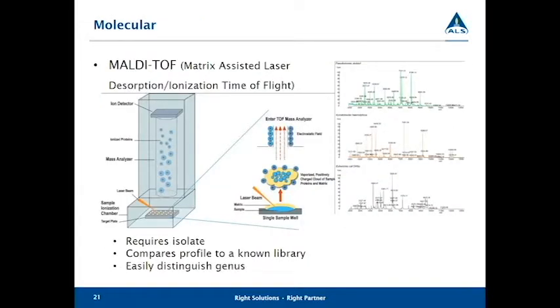The last technology that I'd like to talk about is what I consider molecular-based technologies, and really there's one major one out there right now, the acronym is MALDI-TOF, and MALDI-TOF stands for matrix assisted laser desorption ionization time of flight. Basically, we're using mass spectrometry, and it's been modified so that it can be used to identify organisms. The downfall to this is you do require an isolate for this technology. So as a screening technology in a mixed culture, it's not real viable. You still have the time and expertise needed to get to a specific isolate.